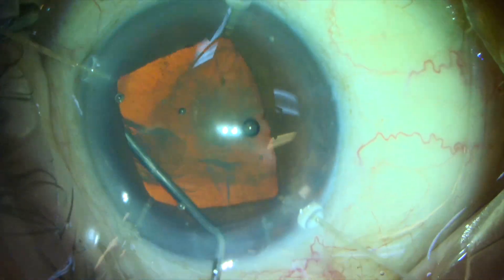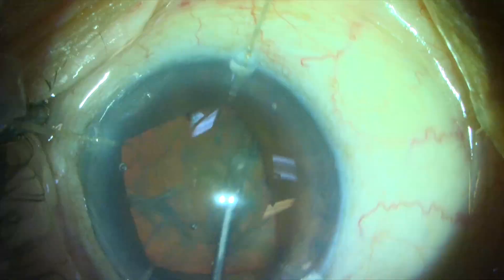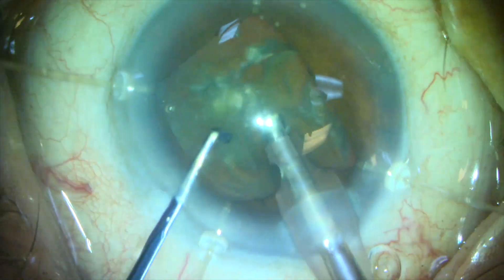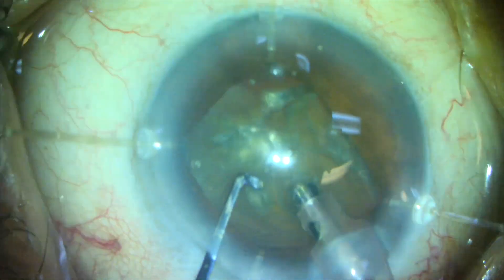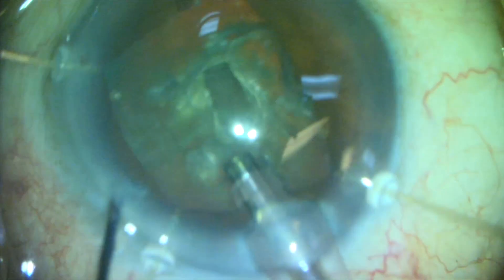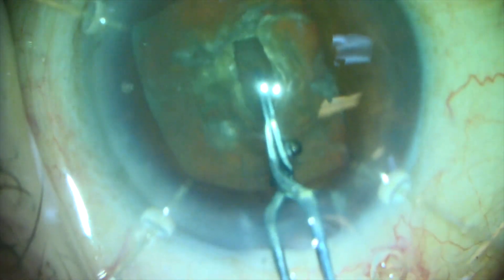So here's how we use it. After we've created our capsulorrhexis and performed a thorough hydrodissection, we introduce our phaco tip and create a central groove that's probably about half to one-third the thickness of the nucleus. We fill the eye with a generous amount of viscoelastic and then introduce the Inamura pre-chopper, push posteriorly toward the retina, and then expand the pre-chopper.